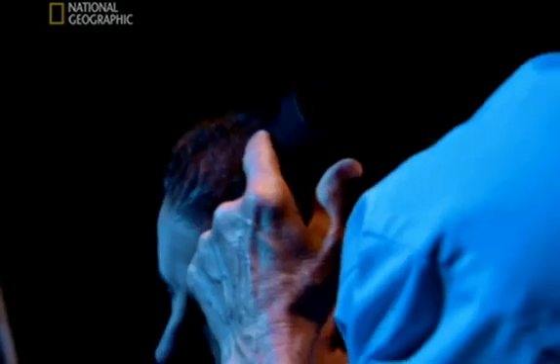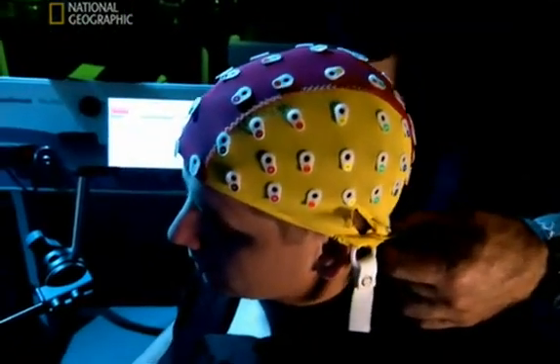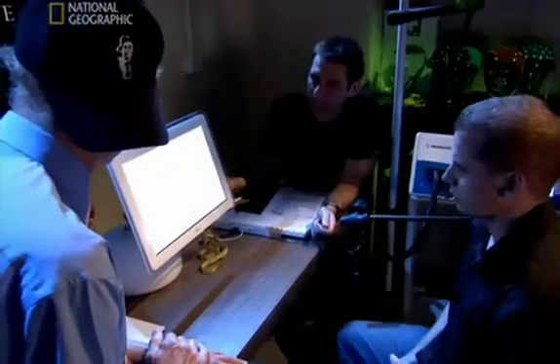And the question is, why can't we all do it? Snyder has designed a controversial experiment to see if we can all do it. Using a revolutionary technology, Snyder asserts that he can artificially turn on anyone's hidden potential by temporarily turning off part of their brain. Snyder has recruited Micah Ray, a university student, to be his guinea pig, and has devised a series of tests that echo savant skills to administer before and after he stimulates his brain.